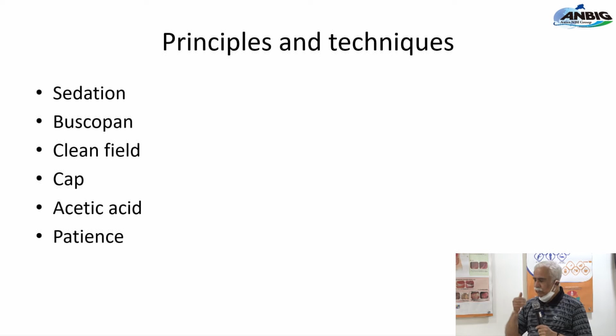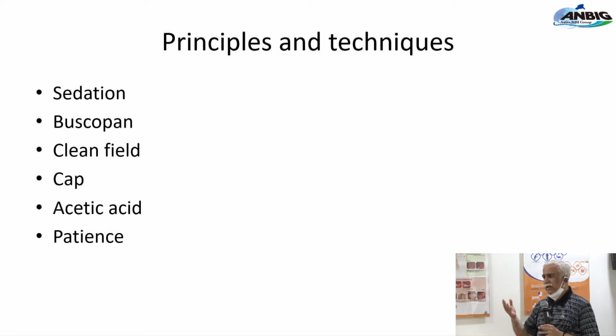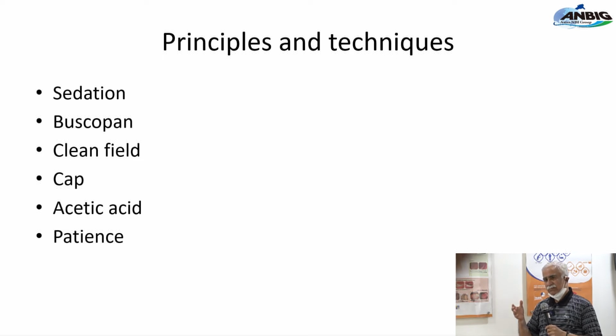A routine you can finish with experience. You can quickly look and say, okay, all this looks normal. Then you say, oh, something looks wrong here, I'm going to interrogate, and you may be spending another extra minute on it. So it really does not take that much time. I have a lot of people telling me we do lots of endoscopies, I can't give more than 2 minutes, 3 minutes. But believe me, once you get experience, it actually doesn't take more than 4 minutes, 5 minutes. So please don't start off with negative thinking, "it won't happen for me." Don't do that. Everyone can do it, it just takes that little extra time, and it makes a big difference.